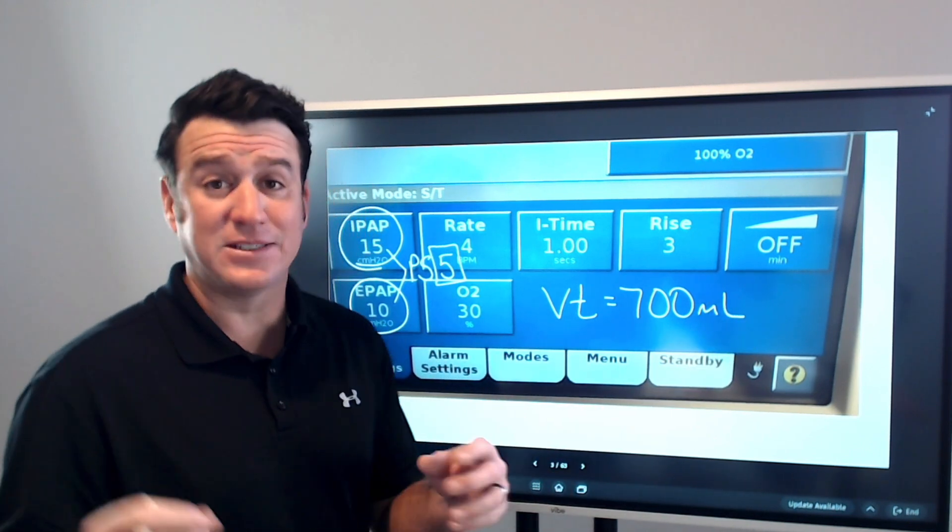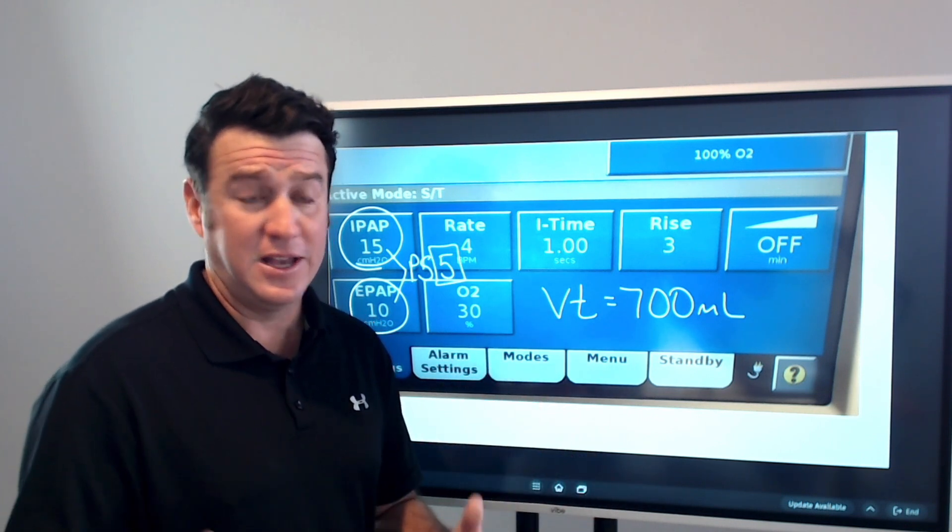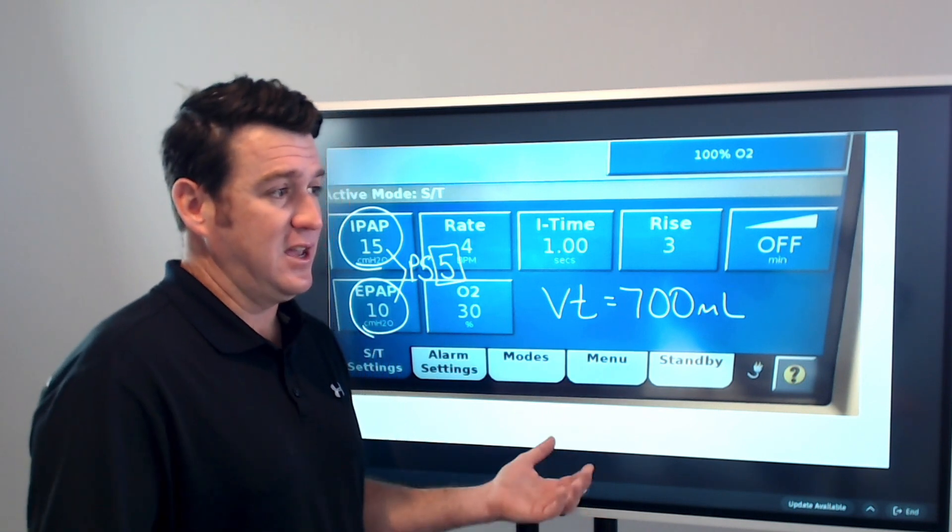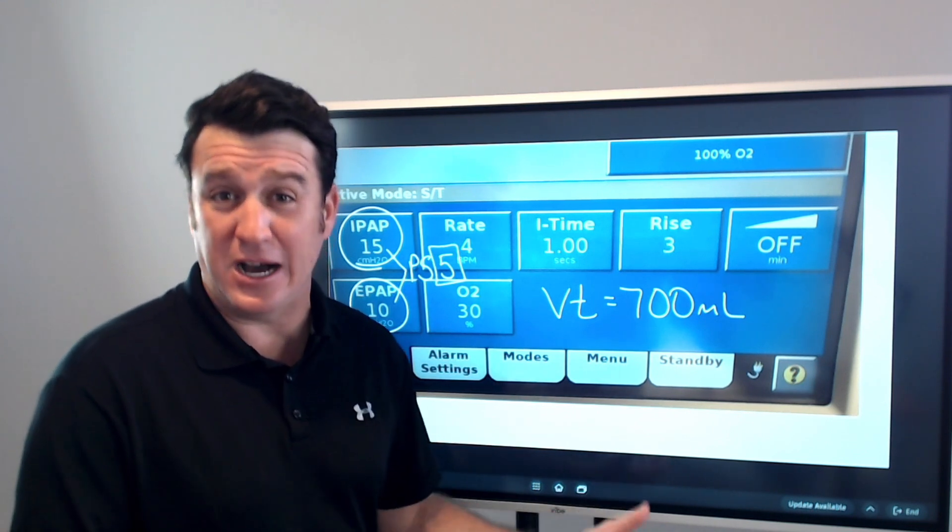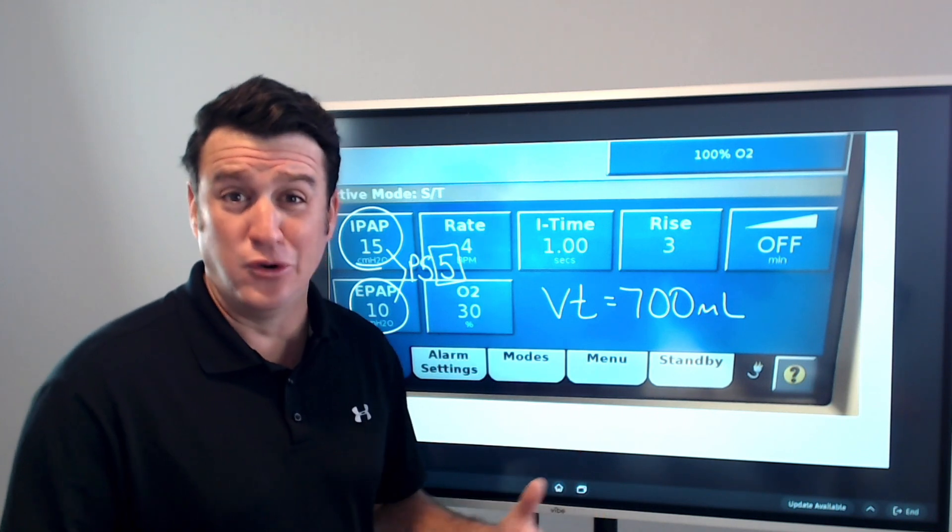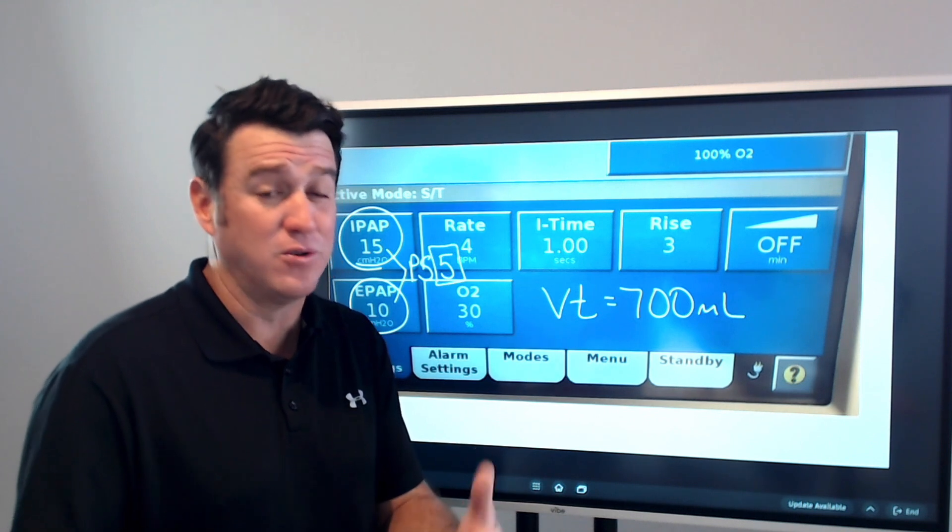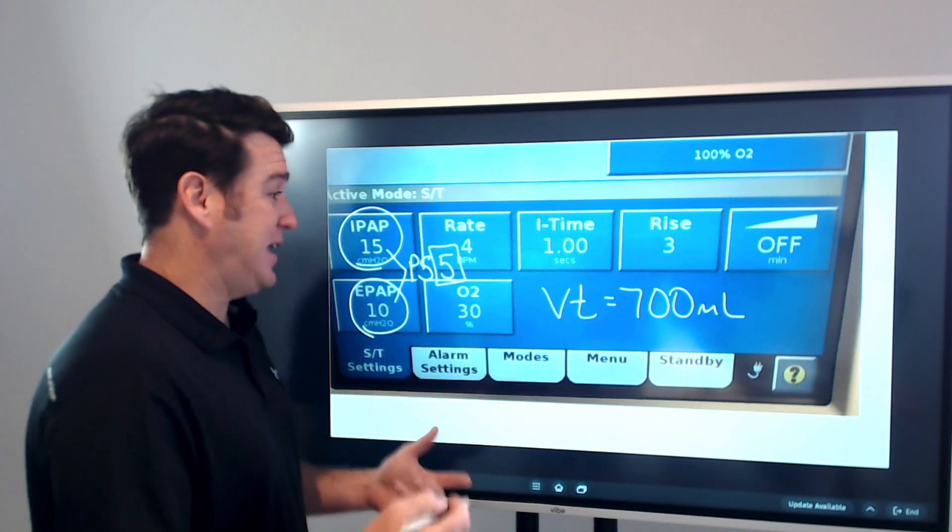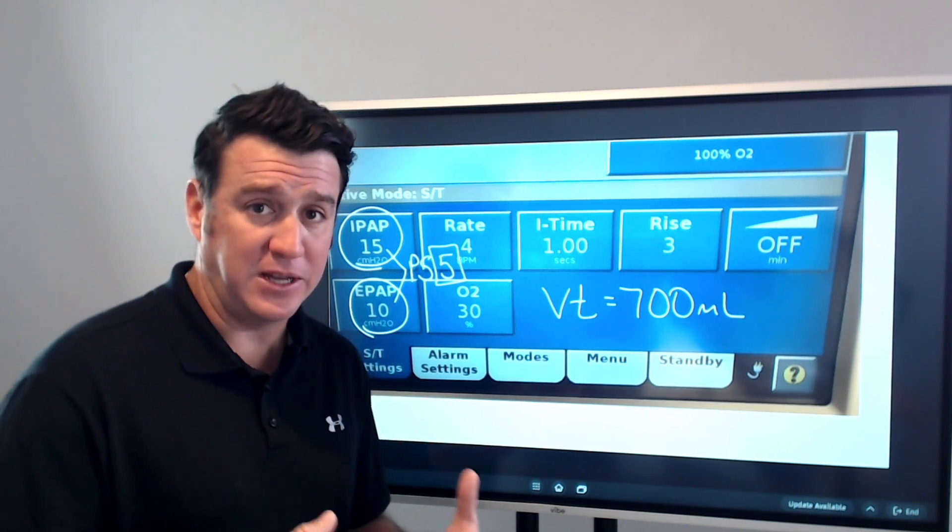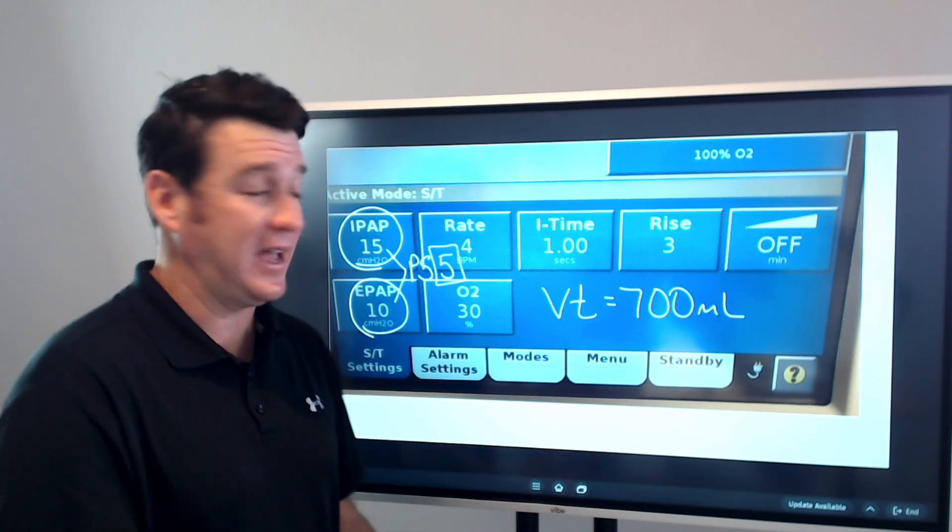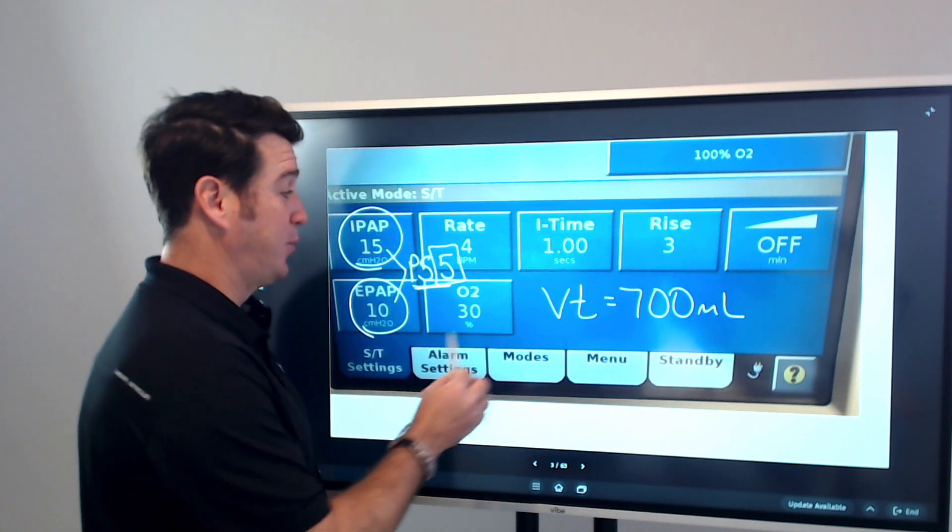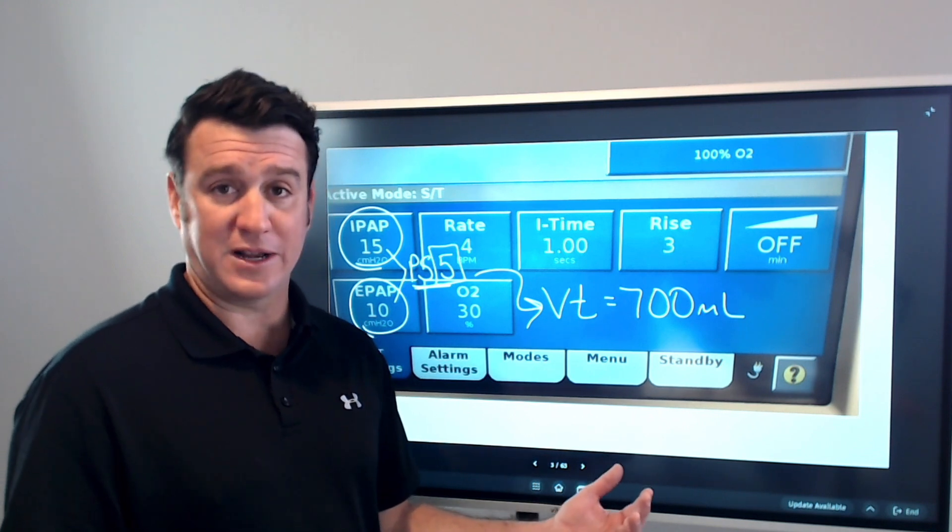That's a good tidal volume. They were anywhere from about 600 to 800, averaging about 700. Patient was breathing about 12 times a minute, gives us a minute ventilation of about 8.4. Slightly elevated, but the patient's in the hospital, had just been extubated the day before. So I'm not expecting a normal minute ventilation at this time. I'm thinking right now, I have a blood gas, we do not have a ventilation problem. This patient is ventilating just fine. Lots of supporting data on that - not just the blood gas, but also the fact that this patient is needing only a minimal amount of pressure support to generate an effective tidal volume.